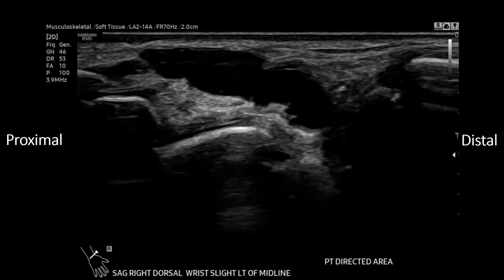So case one — this was a 30-year-old female presenting with a lump on the dorsal side of her wrist. When imaging wrist structures, it's important to use a high-resolution transducer. Here we're using a 14 megahertz transducer.